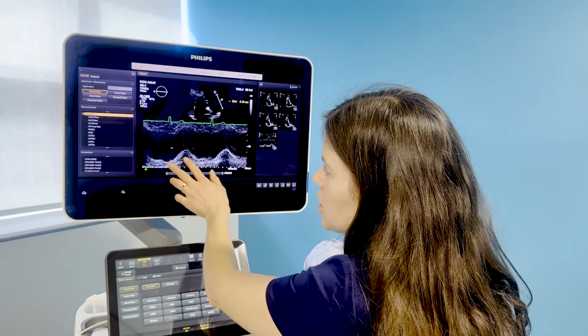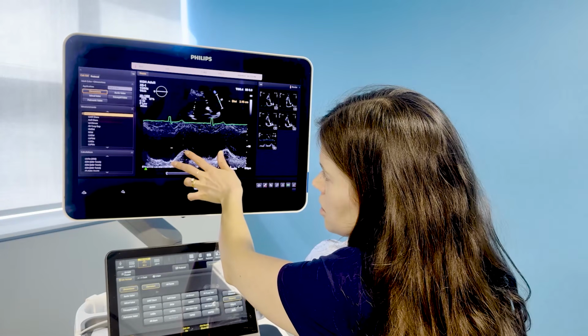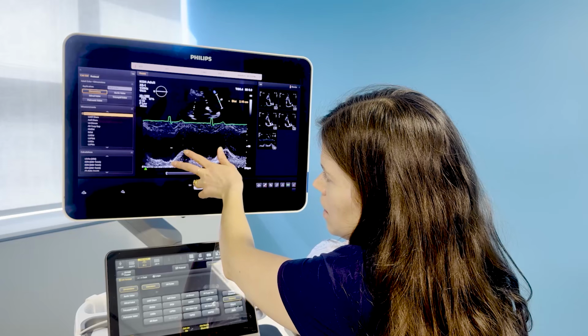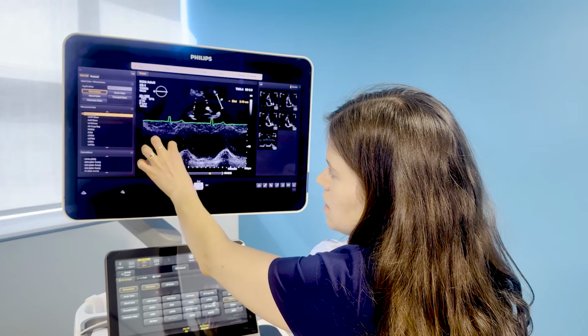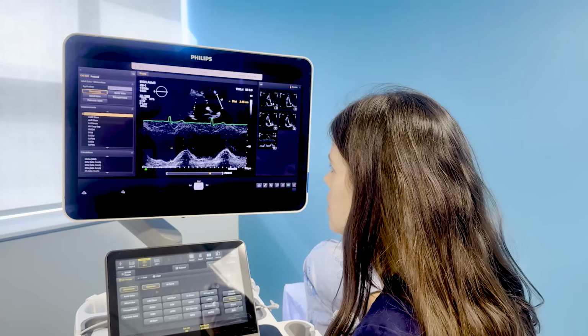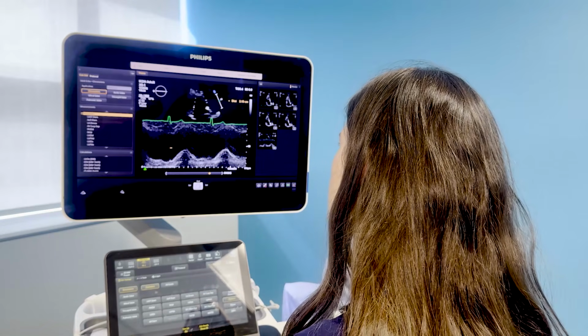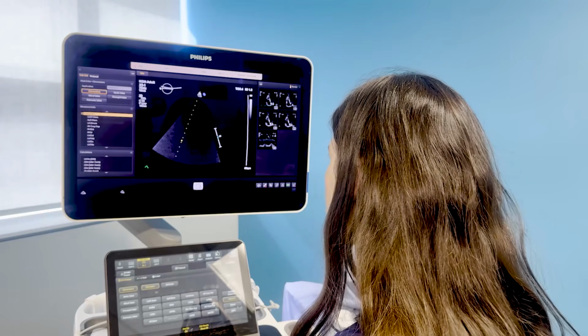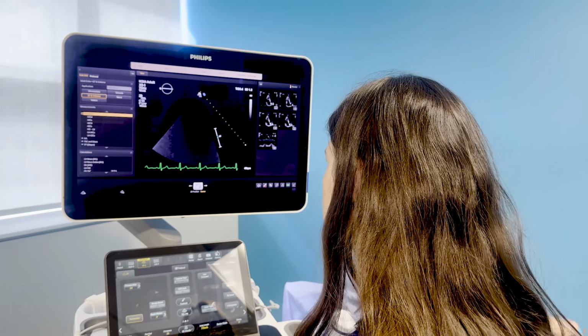But if you were to measure right along the line, which I like to do actually, it doesn't really make a difference going to the side because it's only taking the vertical height component. Okay. Yes. Got it. All right. So normal TAPSE is greater than 17 millimeters.